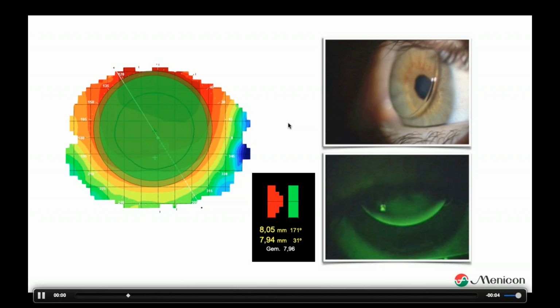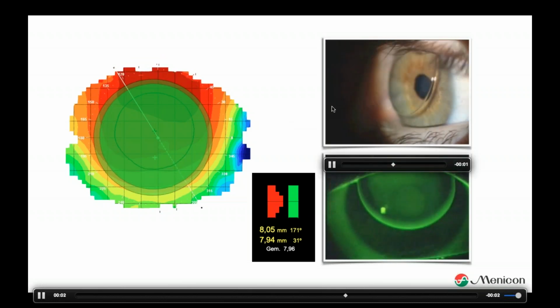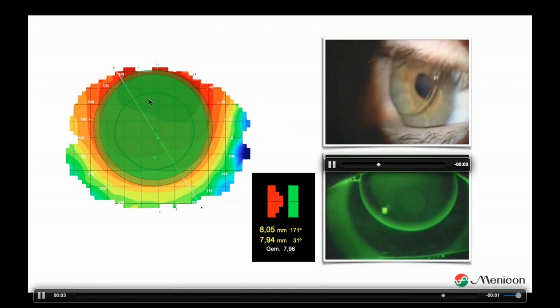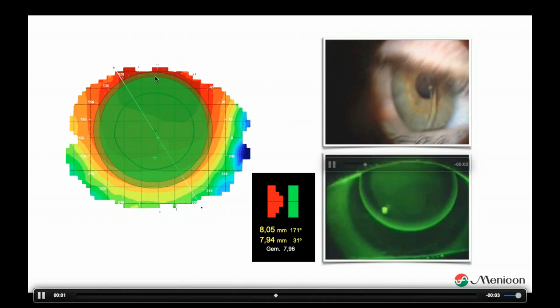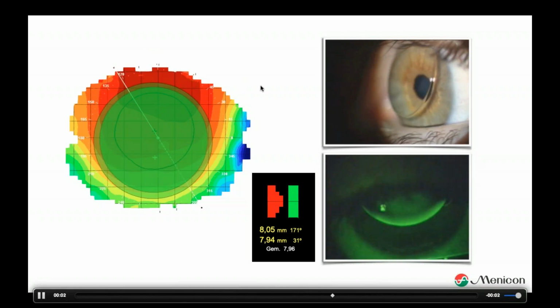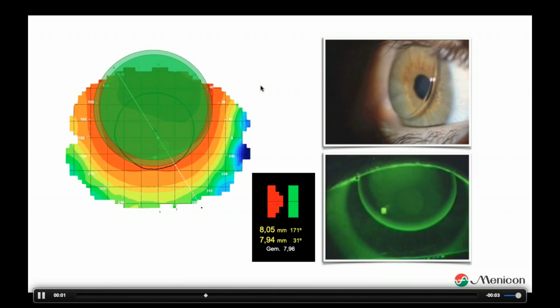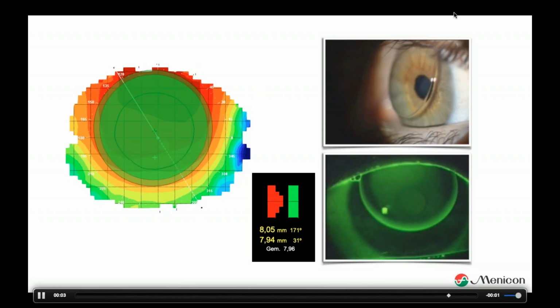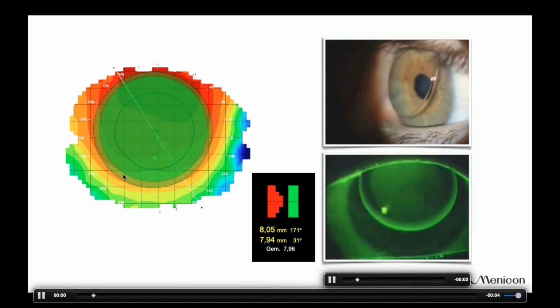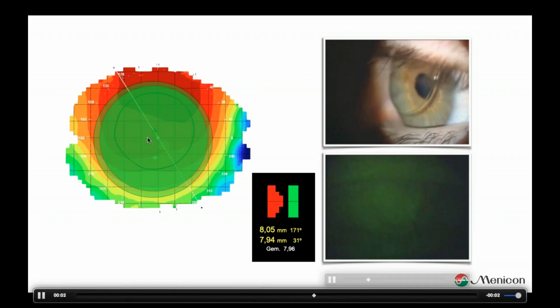But in fact, in this case, the lens is exactly in the place it should be, because the superior part is steep. This is the best place for the lens to fit. So in fact, it is not decentered. Well, the patient will be satisfied because you are looking probably at the border of the optical zone, but in fact the lens fit is perfect.